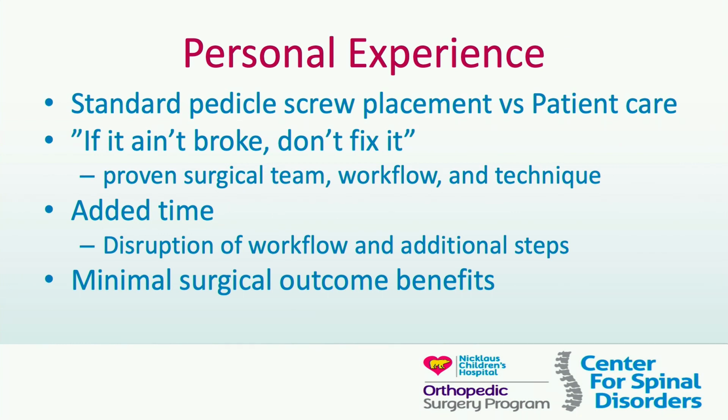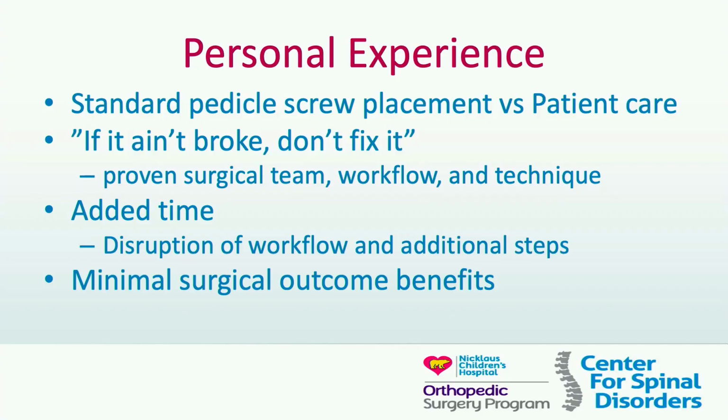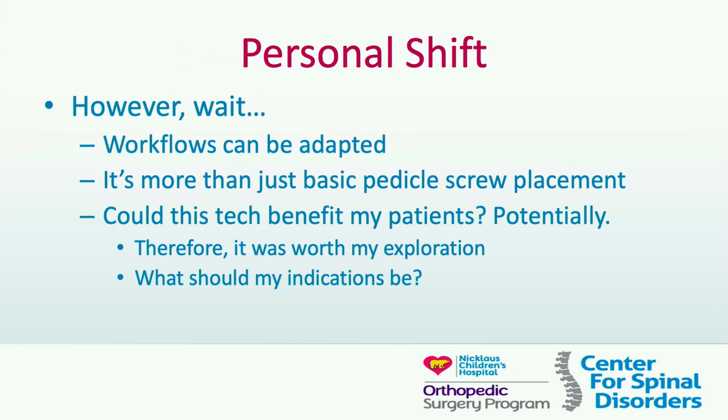Getting into a little bit about my experience with the technology, I did everything freehand early in practice, and I really thought to myself, if it ain't broke, don't fix it. And if navigation was only going to help with placement of standard pedicle screws, how would that really impact patient care? One of the things that we all talk about is that having a good surgical team and a good workflow and a good technique is paramount to a lot of the other nuances of technology. So it really pushed me away from adopting very early. And I really didn't see a significant outcomes benefit with the technology.